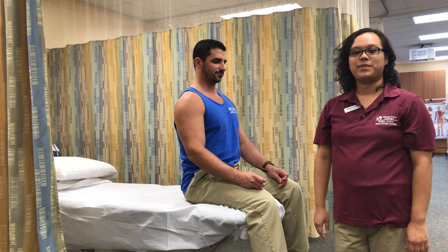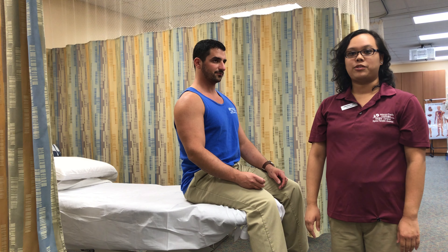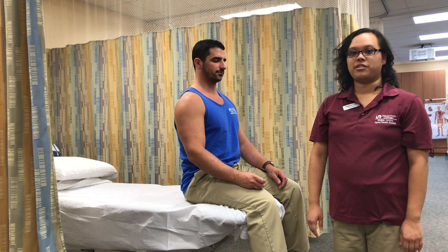Hello, my name is Amanda Lee. I'm a student physical therapist assistant here at Miami Dade College, and today I'll be demonstrating how to measure range of motion using a goniometer for right forearm pronation.